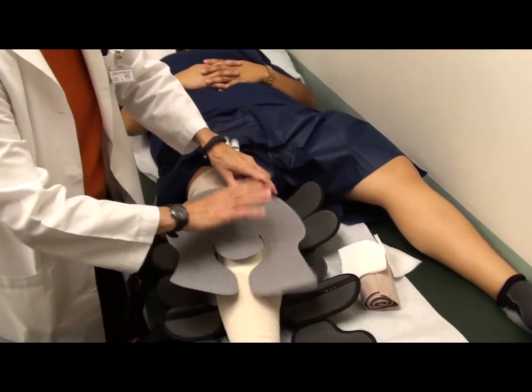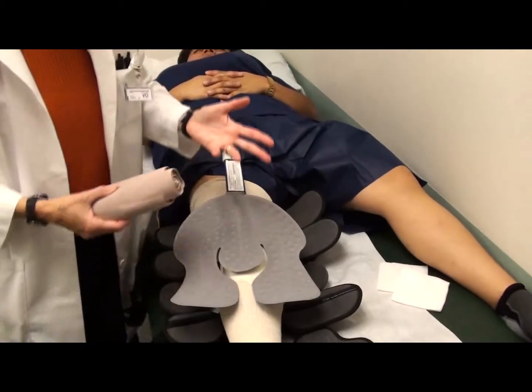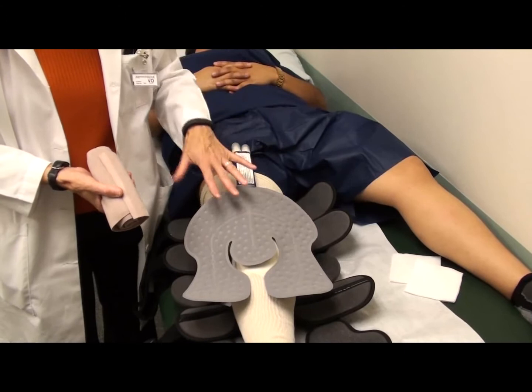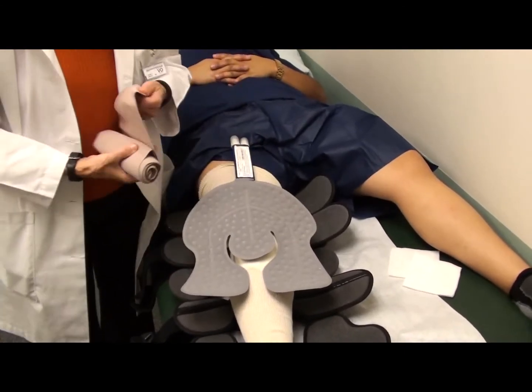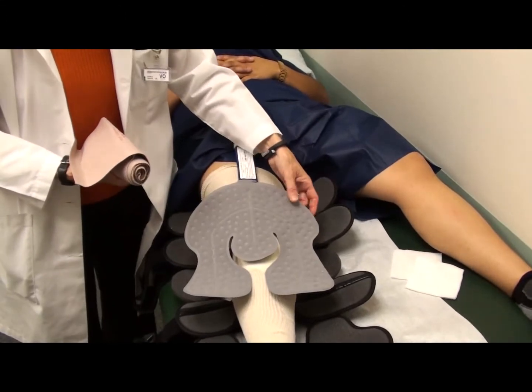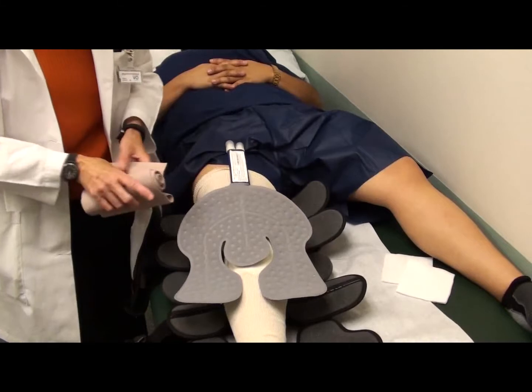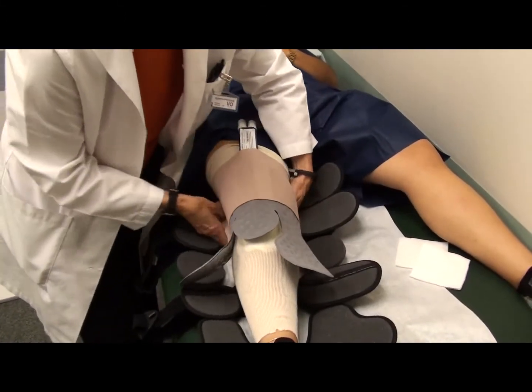The next step is to put the cold pad back on your leg, and at this point you're usually 2 days post-op, so I don't recommend you leave it on 24/7. I want you to take the cold pad on and off your leg every 2 hours, and definitely at nighttime, because at nighttime you want your leg to get a little air, and you'll find that the cold pad side gets a little sweaty, sometimes a little moist. So you take that off when you're not using it, and then you wrap it onto the leg with the ace wrap.